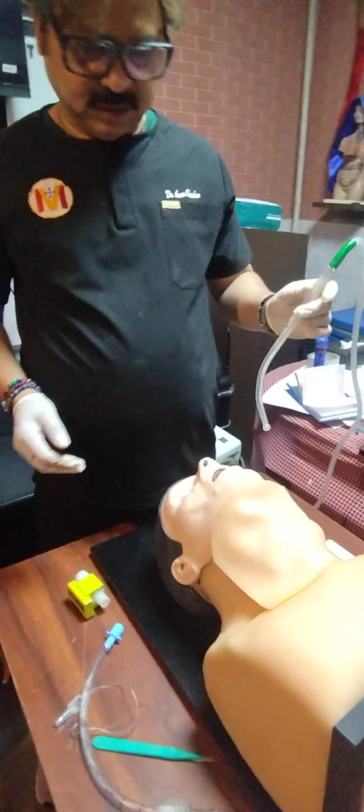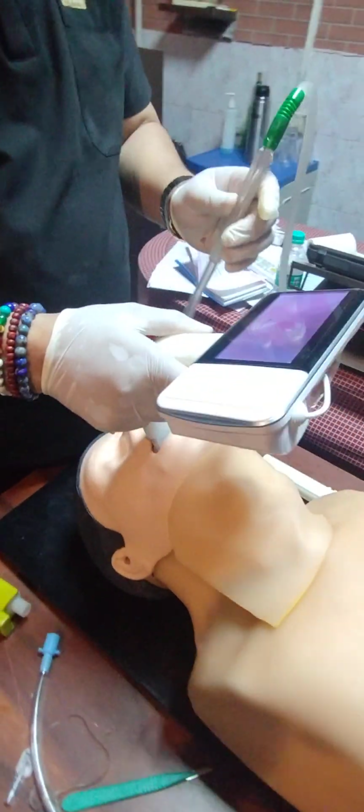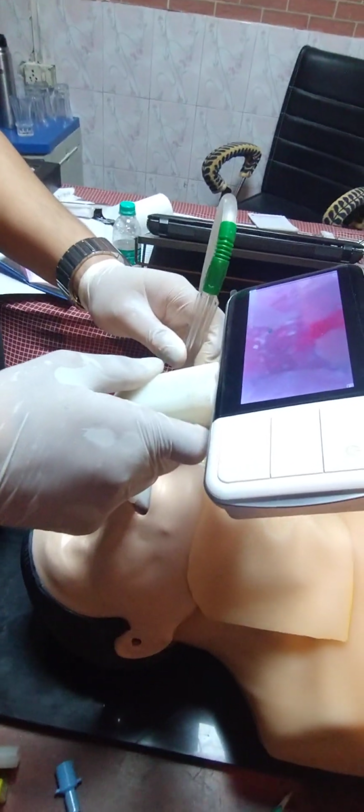Okay, now the second scenario. Now we will create that vomiting scenario, like that you just go inside casually, but should not ever go. You should go with the suction. So we'll show you.